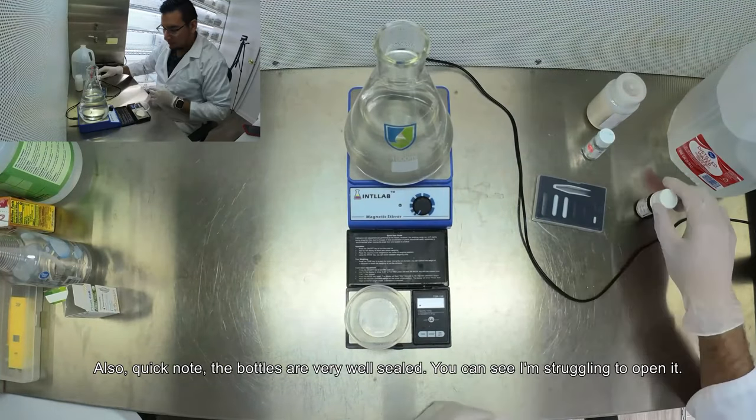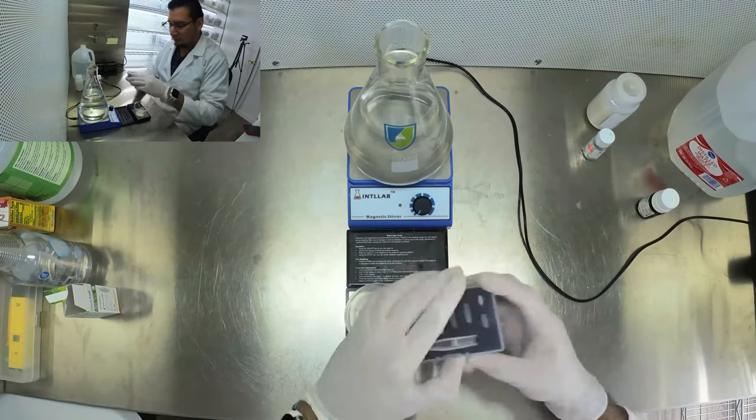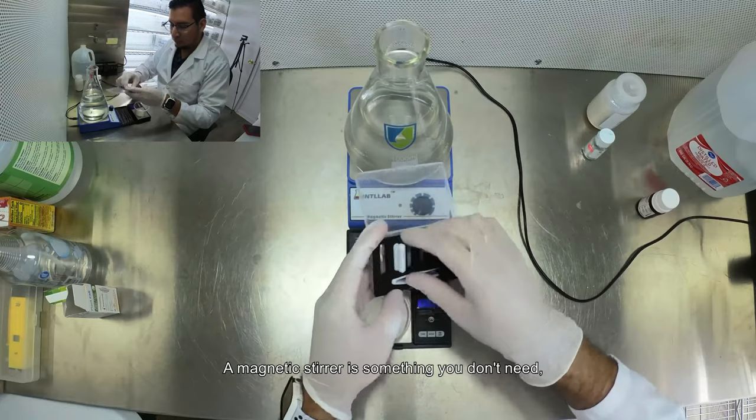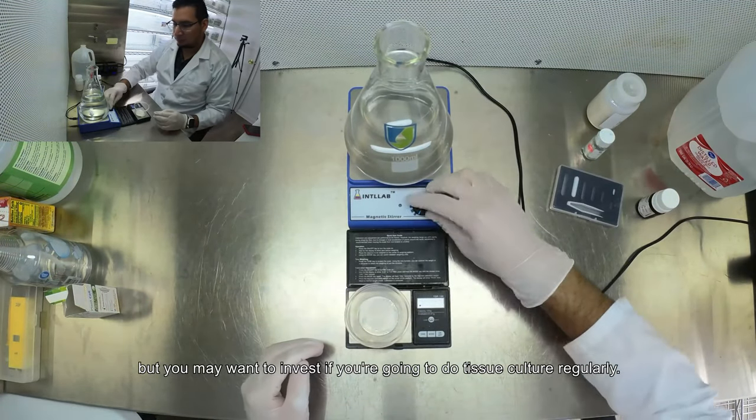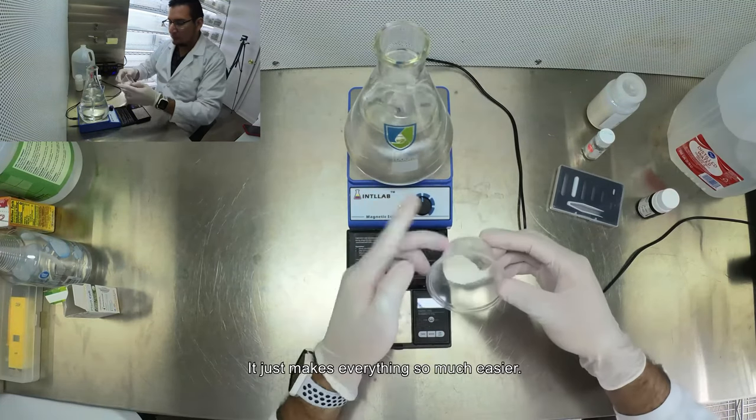A magnetic stirrer is something you don't need but you may want to invest in if you are going to do tissue culture regularly. It just makes everything so much easier.